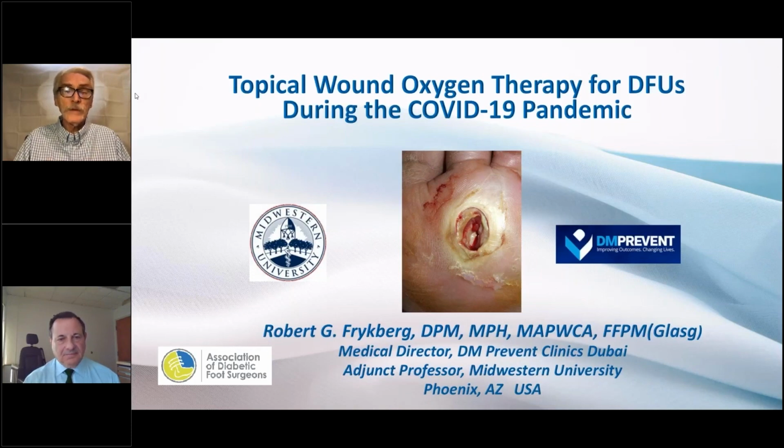Correct. You know, a lot of these people will just walk around barefoot or in slippers at home, and we know that that's not good enough. So it's very, very suitable for home care. And yes, you can just prescribe it, and it can be delivered to the patient's home, and the technician will train the patient on how to deliver the therapy. They're not going to do any wound care, but they just show the patient how to do the therapy. So I think this technology is perfectly ideal for the new paradigm in care that we're seeing right now as a result of this COVID-19 pandemic.